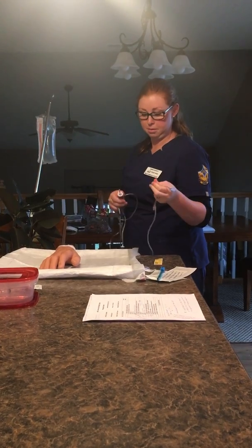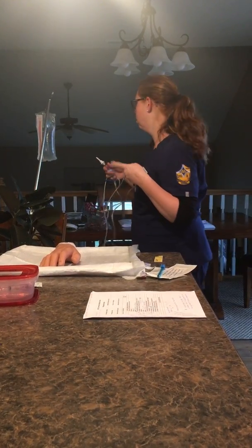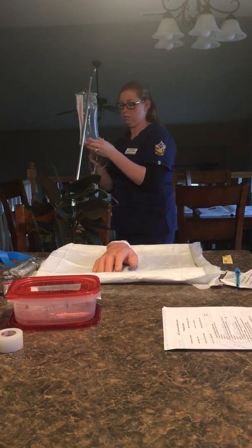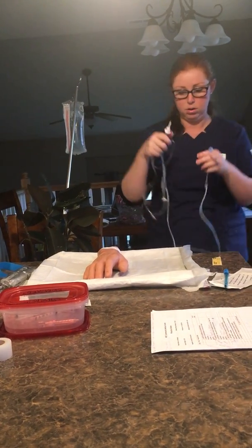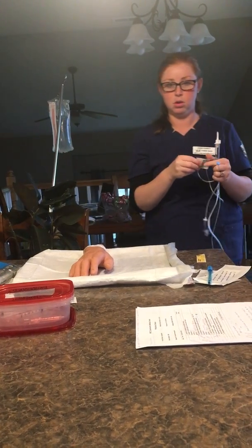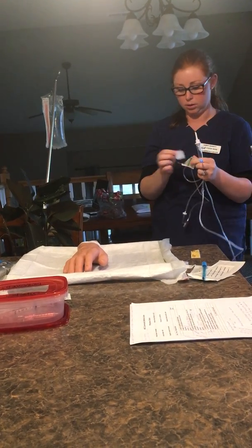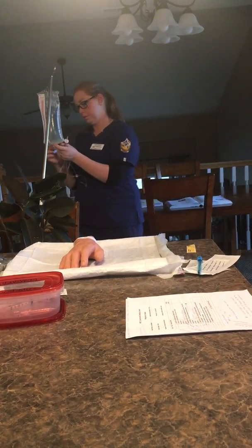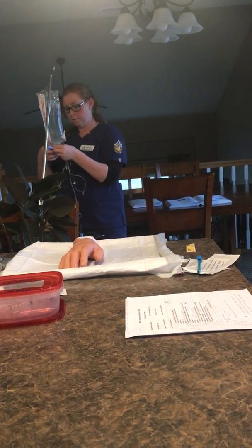And I'm going to go ahead and make sure that this is clean. I'm just going to go ahead and wipe this off. I did just take it out of its sterile covering, but I just want to make sure we're good there.